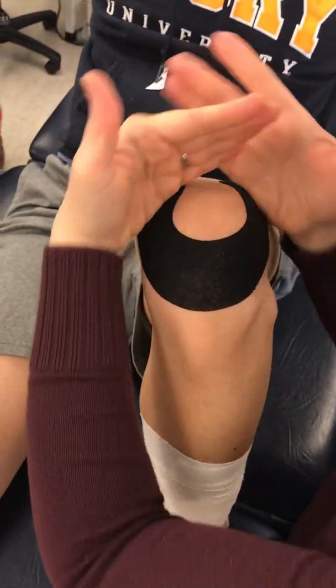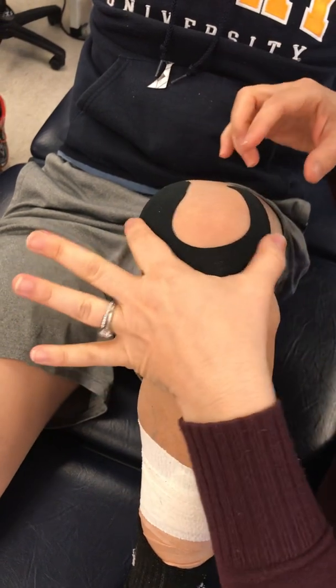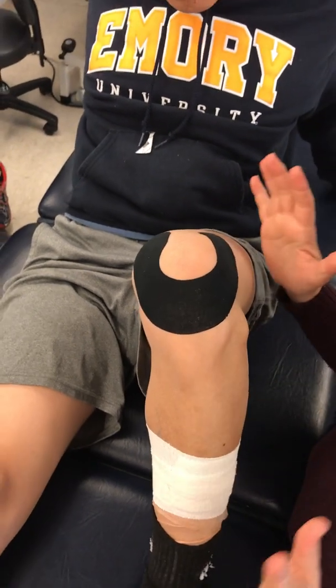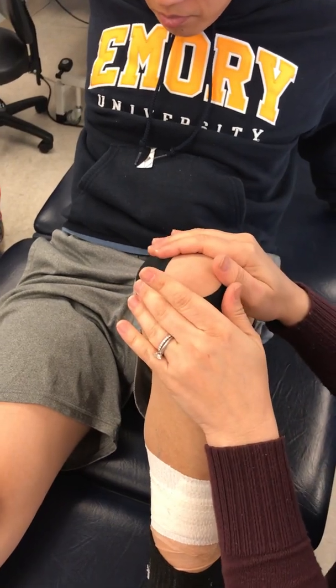And so what I like to do is envelop the whole thing. You know those knee braces that leave the little circular hole and they have a little U shape under? We just recreated that using a Kinesio piece. Really, really simple for somebody who you need to think about tracking in patellofemoral.